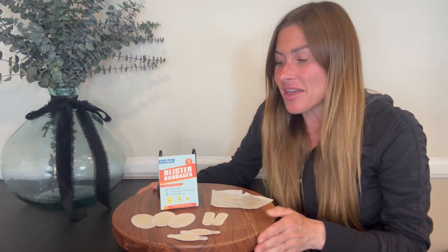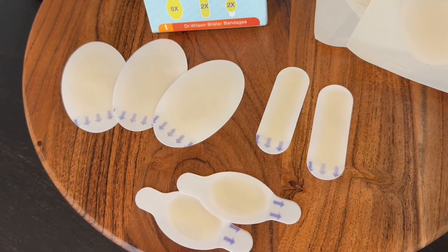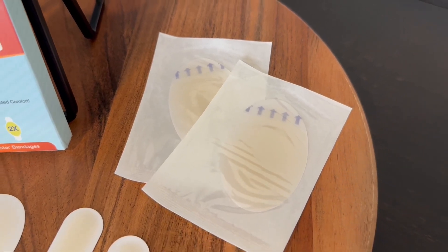First off, you get nine bandages with this set. They come in three different shapes and sizes and each one is individually packaged so that it stays sterile until you are ready to use it. These blister bandages are great for protecting a blister once you have one.